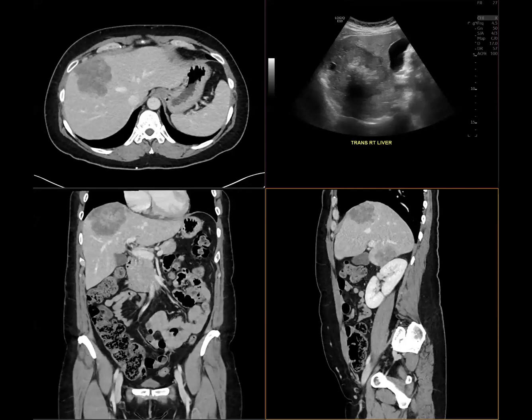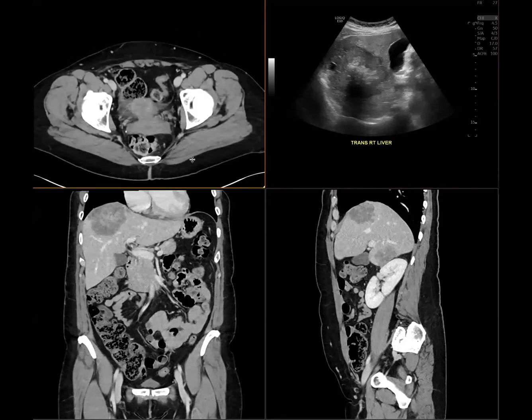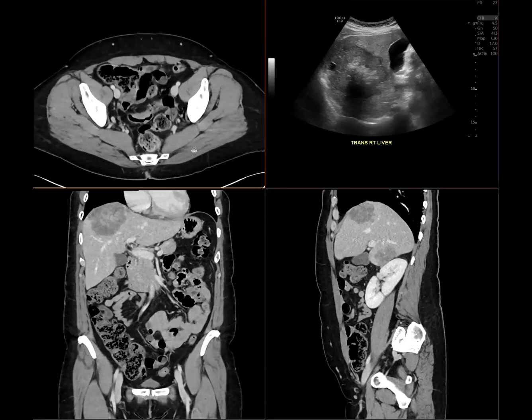Ben, I have a quick question on that one. Yes. That is a great pickup. Do you know if those were mucinous? Like if the colon cancer was actually mucinous? That's how the radiologist came to that conclusion. She saw these intrahepatic metastasis, and she thought about a mucinous colon cancer, and she found that lesion that I showed. And it's a subtle lesion that someone could blow by and not notice if they hadn't thought of it.